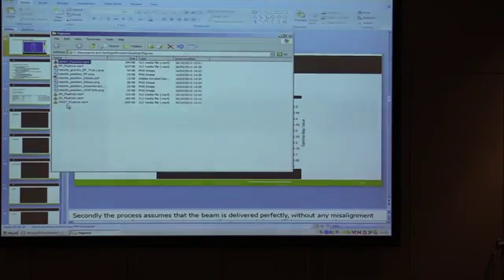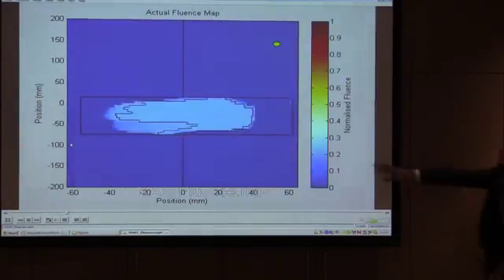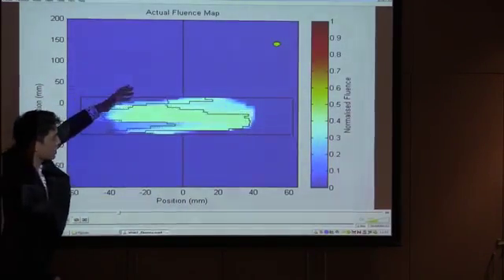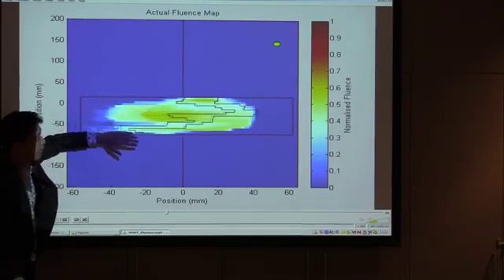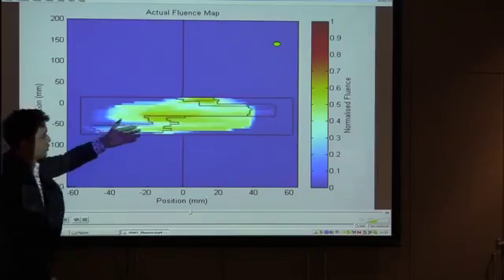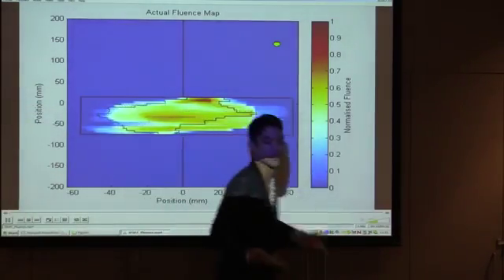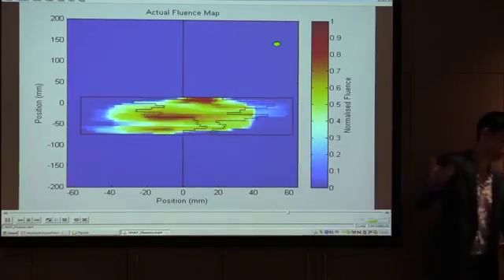This is just, I guess, a little something. So you've got bank B, bank A over here, for example, moving. So when the radiation is being delivered, you're adding the dose to all the areas where there's a gap between the leaves, and that's how a dose distribution can be built up from the ground, for example.